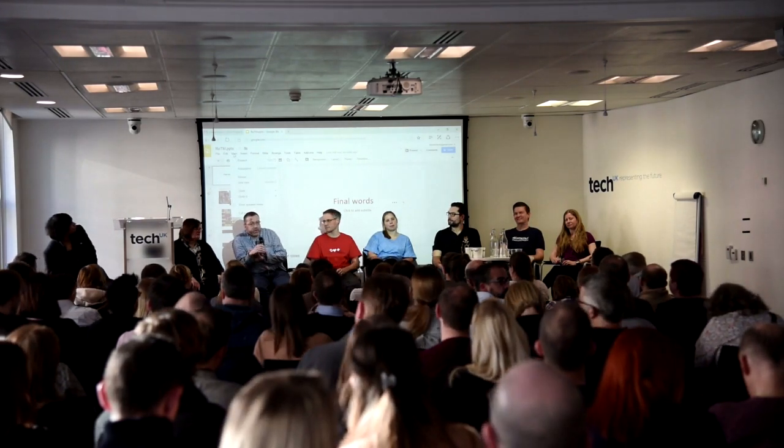So my question was maybe slightly controversial. There's a discussion, as we move towards closed loop systems, about the hypo setting of 4 being the floor, and whether that's a bit high. I was wondering whether any of you have a lower setting, where going below 4 is acceptable. I'll be quite upfront, I set my target at 5, because if you actually think about the percentage accuracy of your CGM, what are you actually going to be at? So I set it at 5, and it'll wander down. I spend less than 3% of my time at less than 3.9, if I believe the stats.